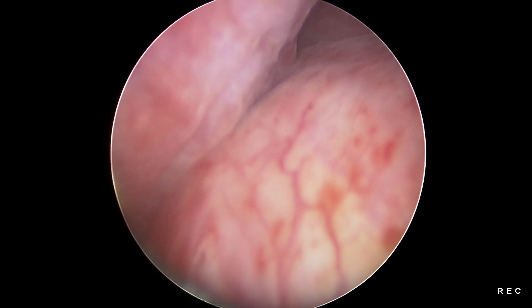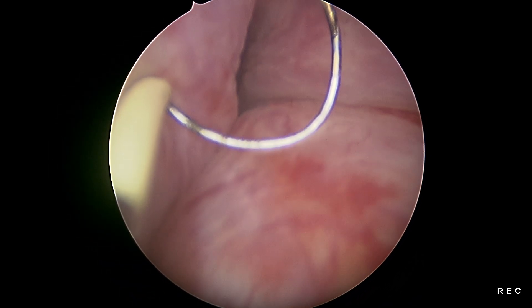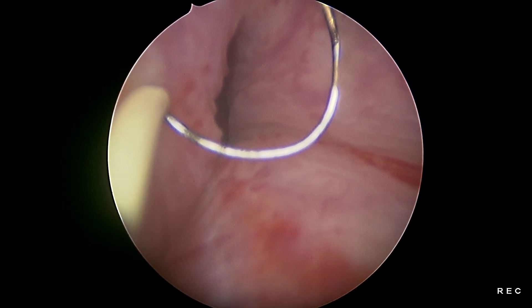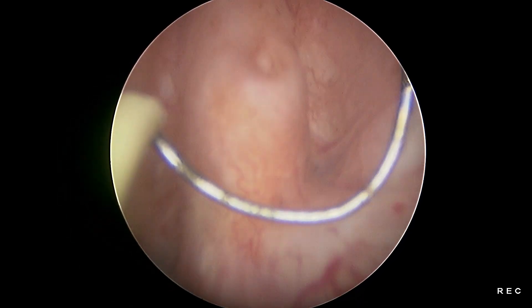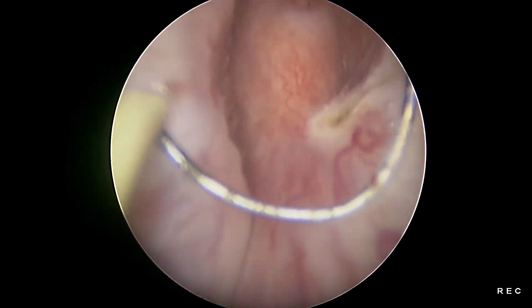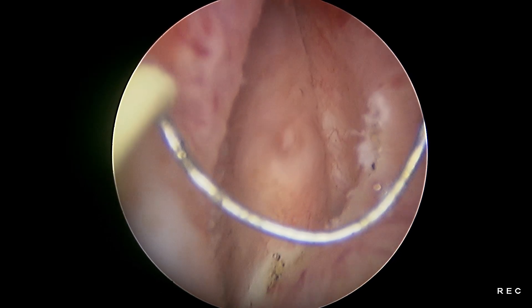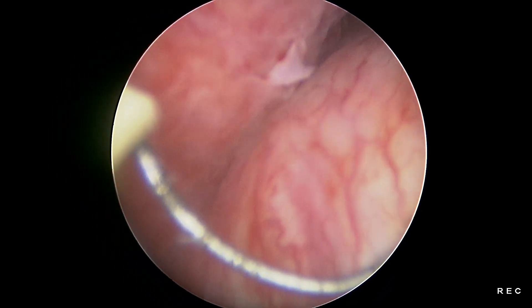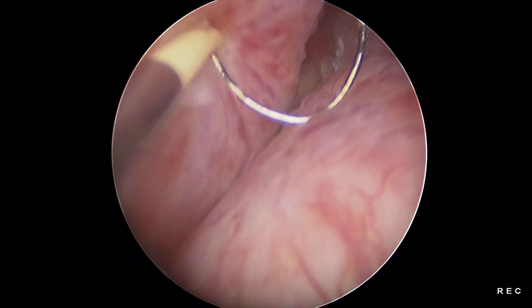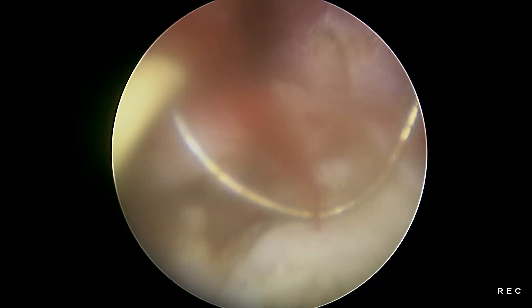The bladder is entered through the Amplatz sheath. We use a standard TURP-set resectoscope with 26 French outer sheath and monopolar cautery. The bladder neck is identified, the prostatic urethra entered, and the verumontanum localized. Verumontanum is marked with the loop to define the extent of resection. Prostatic resection is started; as in standard TURP, resection is done one loop at a time.